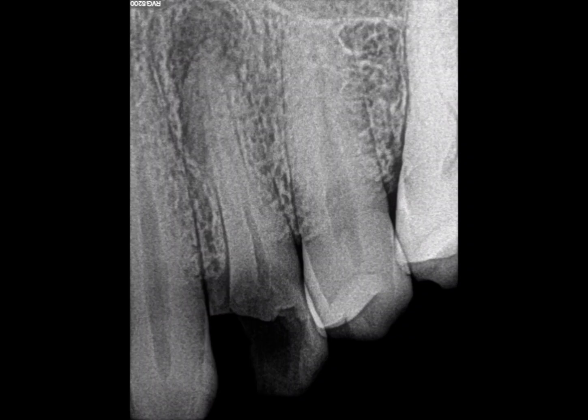Preoperative radiograph. On the preoperative IOPA, tooth number 24 showed extensive coronal destruction along with a well-defined periapical radiolucency suggestive of a chronic periapical abscess. Clinically, the tooth was non-restorable, making extraction and implant placement the most suitable treatment option.